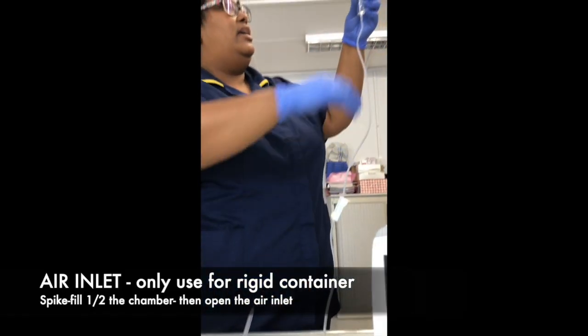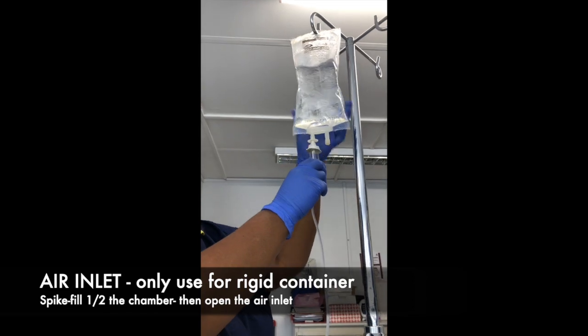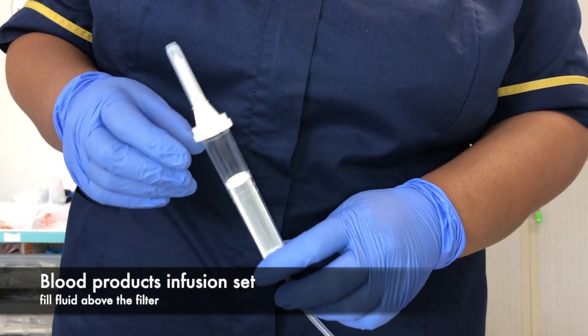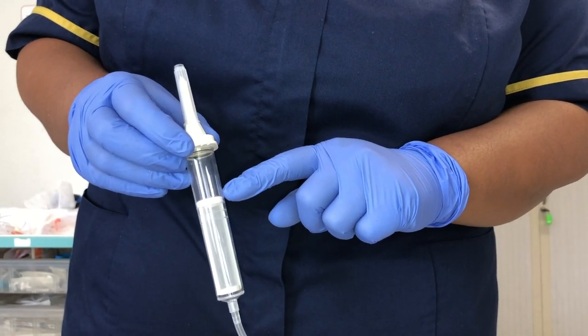With a flexible bag like this, you don't have to open the air inlet. If you're using a rigid container, ensure that you spike the bag, fill your chamber halfway, and then open your air inlet. If you will be giving any blood products, you will spike your bag and ensure that you fill your chamber above the level of the filter.